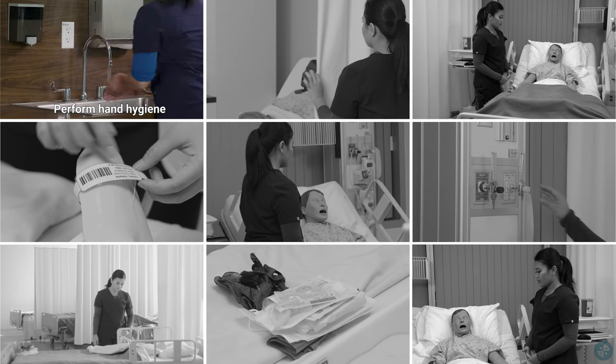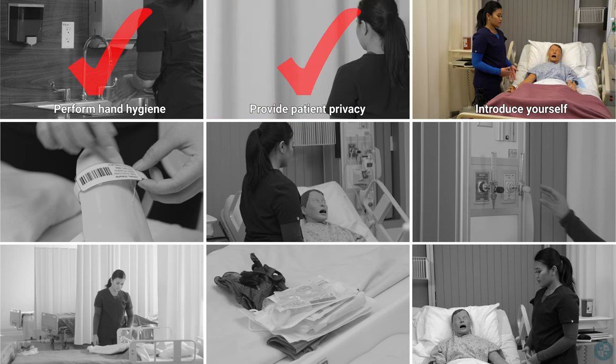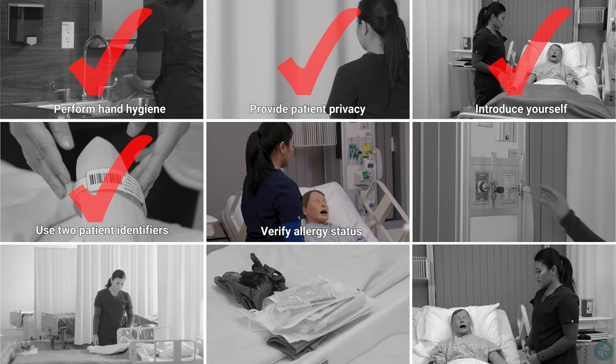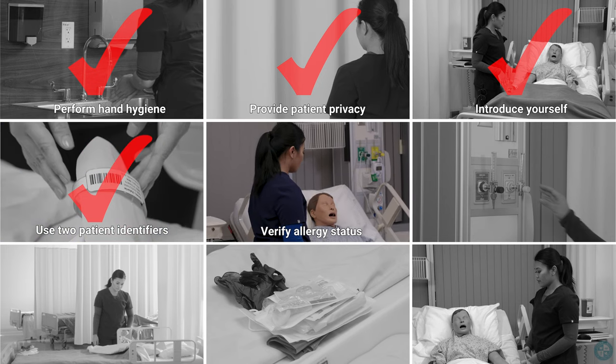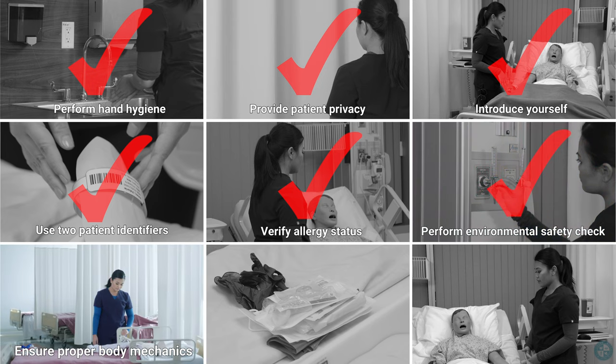Perform hand hygiene. Provide patient privacy. Introduce yourself. Use two patient identifiers. Verify allergy status. Perform environmental safety check and ensure proper body mechanics.